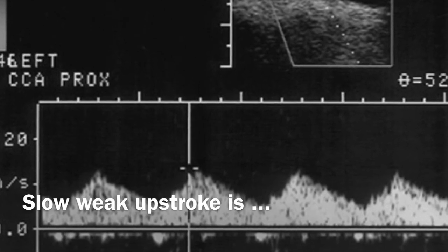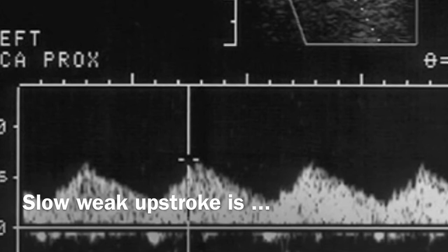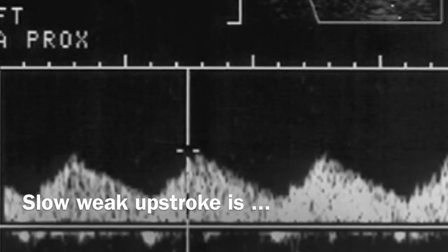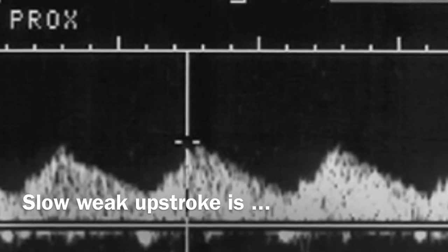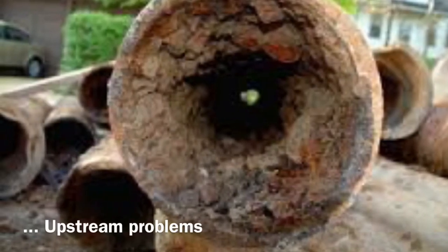After digesting the info I've just mentioned, it's easy to understand that when examining a distal artery and observing a weak upstroke, slow flow spectral wave, you understand that a problem lies proximally, from heart problems down to arterial occlusions, and you know you have to do some work up there to demonstrate the problem.